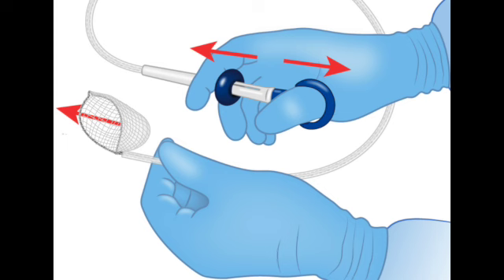Okay, so that makes sense. High-tech procedure meets specialized plumbing almost. How do they actually solve this problem then? They use something called a polyp trap. Think of it like a special filter attachment. And the procedure requires a really specific adjustment right away. You have to physically disconnect the normal suction tube right where it leaves the endoscope at the outlet.